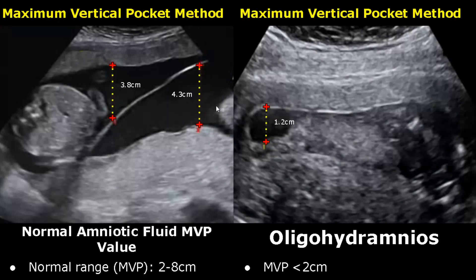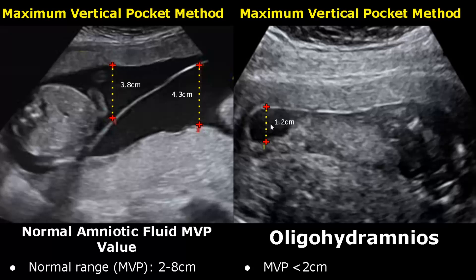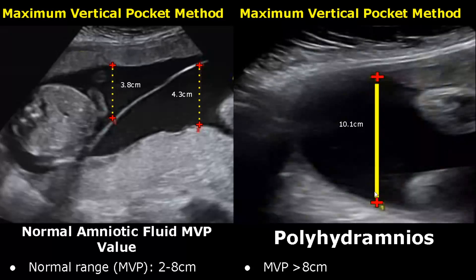For twin pregnancies, the maximum vertical pocket method, or MVP method, is used to assess amniotic fluid volume. The deepest vertical area free of fetal parts is measured. The normal range of MVP is from 2 to 8 centimeters. Oligohydramnios occurs when the MVP value is below 2 centimeters — a very small amount of amniotic fluid. In polyhydramnios, there is an excessive amount of amniotic fluid and the MVP value will be greater than 8 centimeters.